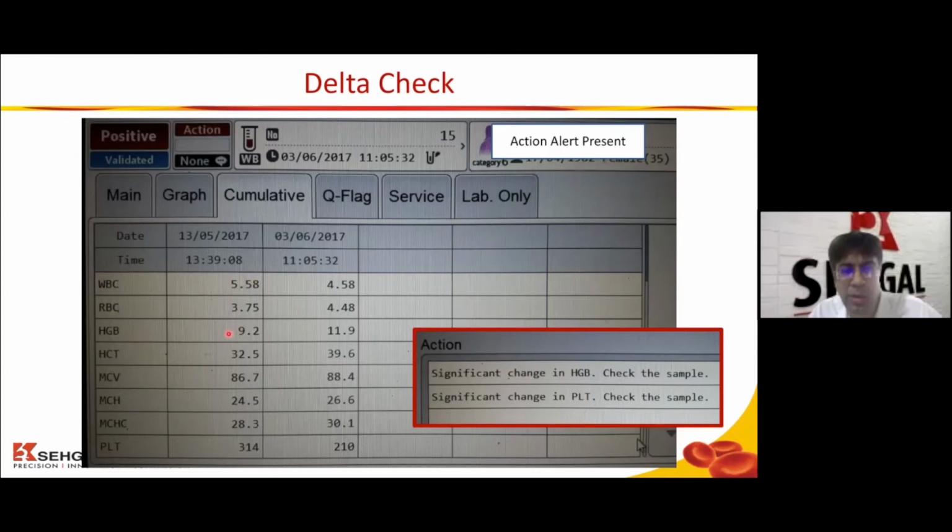Here, there was a huge difference between the hemoglobin, 9.2 to 11.9, and we have kept in our lab a difference of 1 gram. The platelets, we have kept a difference of say 10%. So here it recognized a significant difference. And it said, when you click on this action tab, another tab opens up. It says significant change in hemoglobin, check the sample. Similarly for platelet.